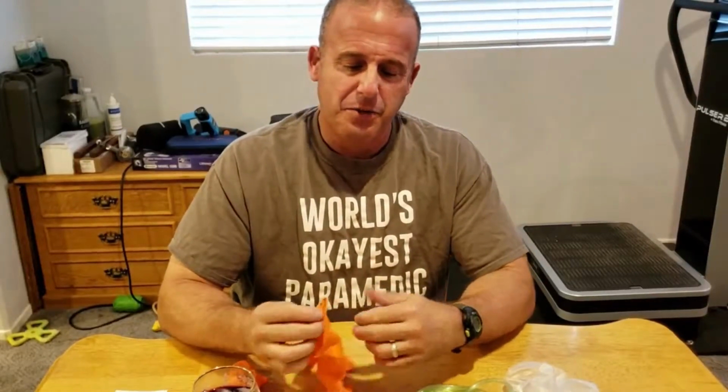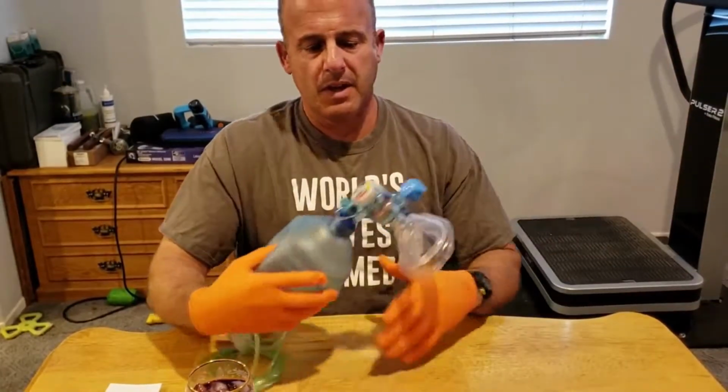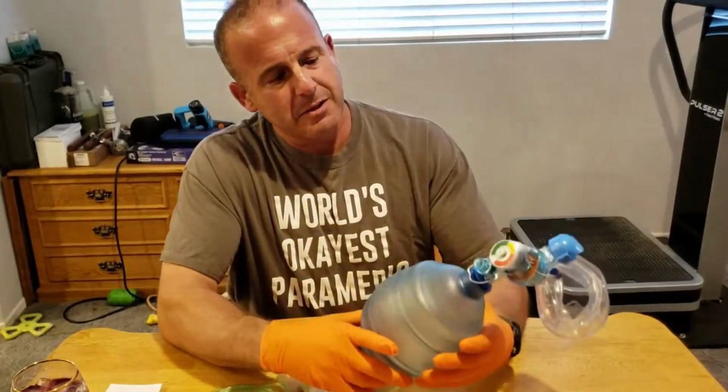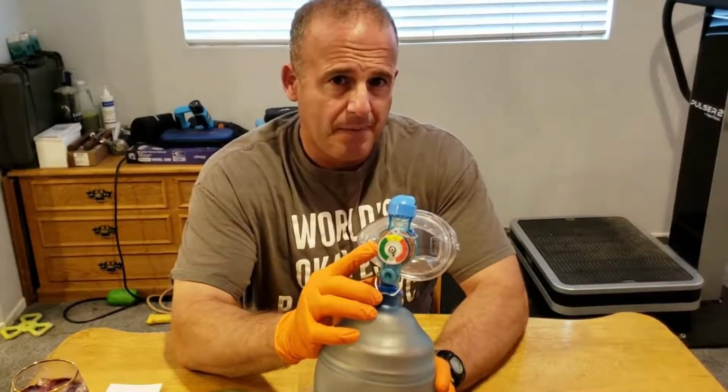I'm here to do a little in-service on the Manometer Equipped Self-Inflating Bag Valve Mask, otherwise what we call a BVM in emergency services. And here is the bag valve mask. This is a Mercury design, and it has a disc-shaped manometer.